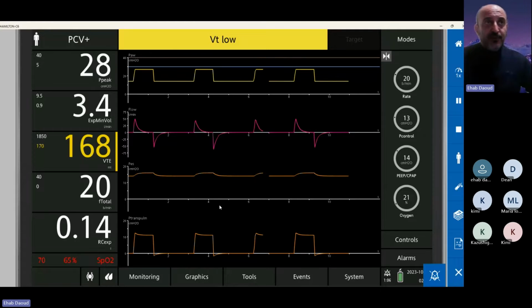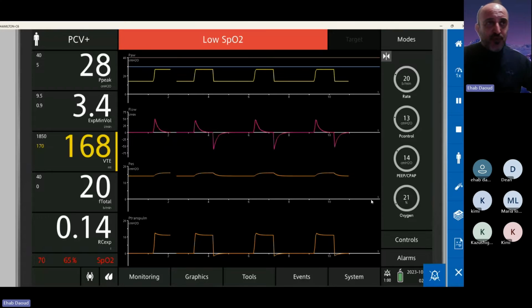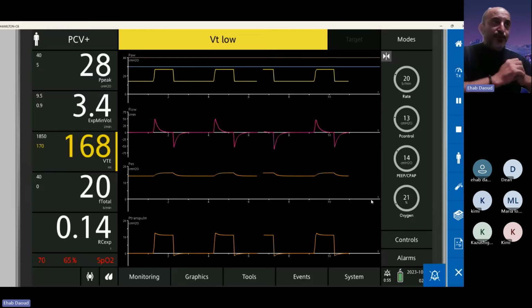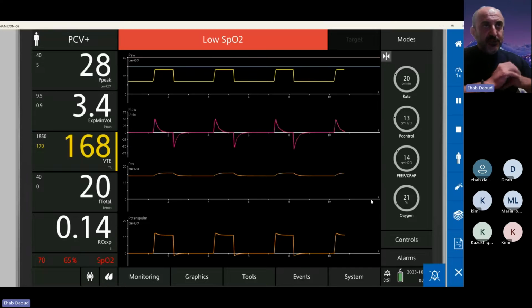There is incremental PEEP. You can keep increasing the PEEP slowly, slowly. That's probably the easiest one. And every time you increase the PEEP by 1 to 2, you have to wait a minute or two. The problem with this method is that it has been shown to be inferior to decremental PEEP.